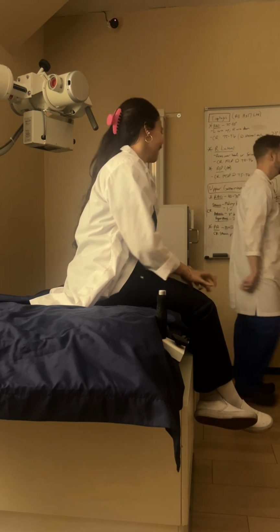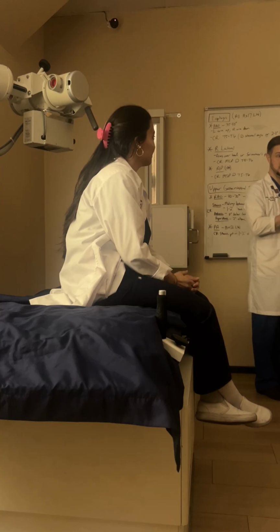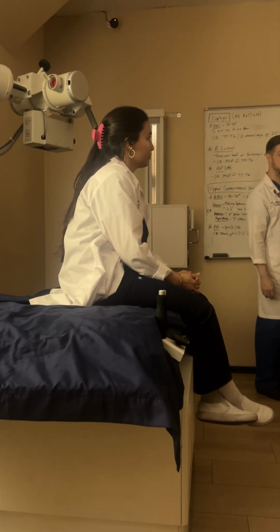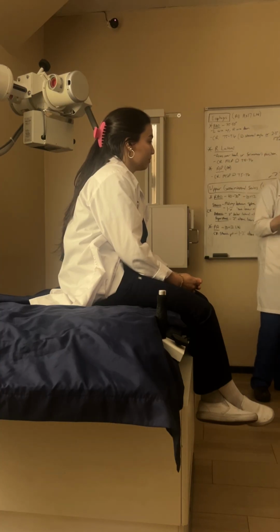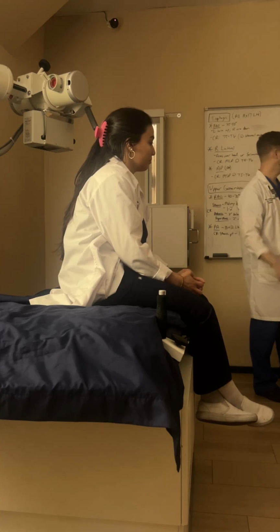Okay, so real quick, and this applies also to the upper GI, as we discussed yesterday. So single contrast versus double contrast. Single contrast for upper GI or enema is going to be looking for extrinsic problems, things that squeeze the colon from the outside or cause what's called a luminal narrowing. Or maybe there's a twisting of the bowel, and we would see the contrast come to a point. Single contrast is going to show that.